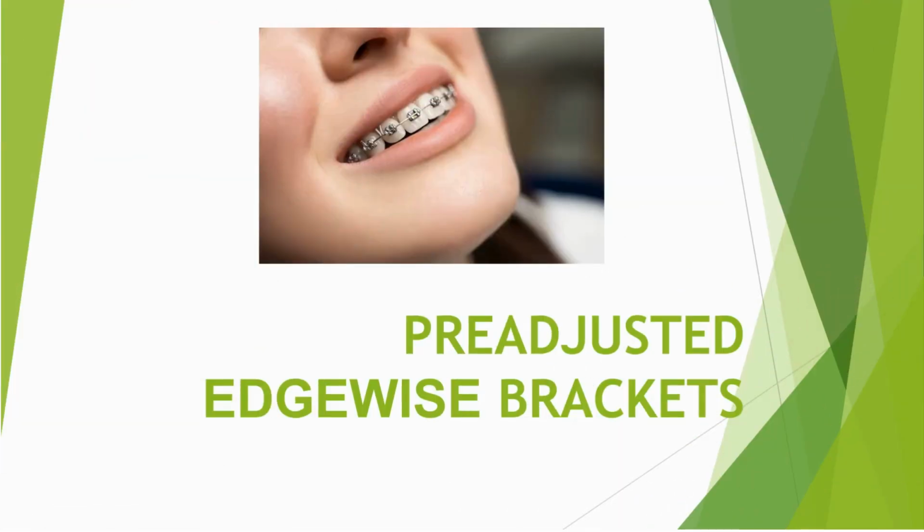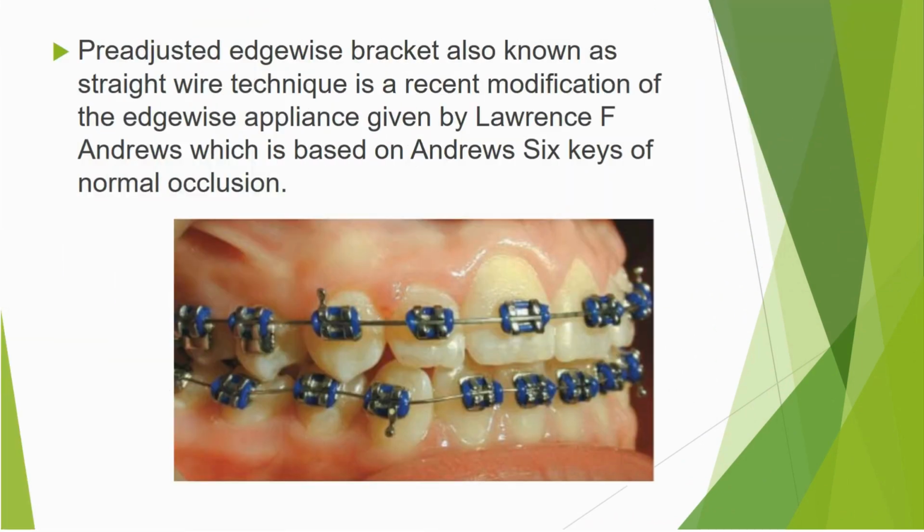Good morning everyone. Today we will learn about pre-adjusted edgewise brackets. Pre-adjusted edgewise brackets are also known as straight wire technique. It is a recent modification of edgewise appliance which is given by Lawrence Andrews, which is based on Andrews' 6 keys of occlusion.